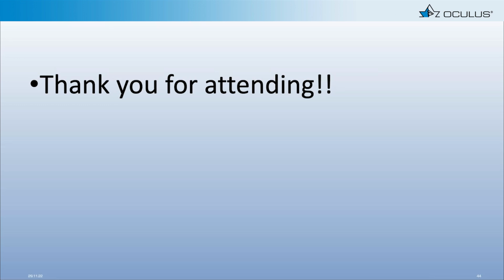And B, again, whether you choose to then take that data and just click a button and use a software program to make your initial diagnostic lens, which in our post-COVID world is more appealing to a lot of people than trying a bunch of lenses on, or whether you prefer to diagnostically fit like I do a lot of the time, it just allows you to go grab the first diagnostic lens out of my set. I know I'm one and done because I know that the one I'm going to put on is the best one I have, and I can look at it and maybe I'll tweak the sag by 100 up or down, or maybe I'll tweak the edges by a couple steps, but I know this is the best lens.